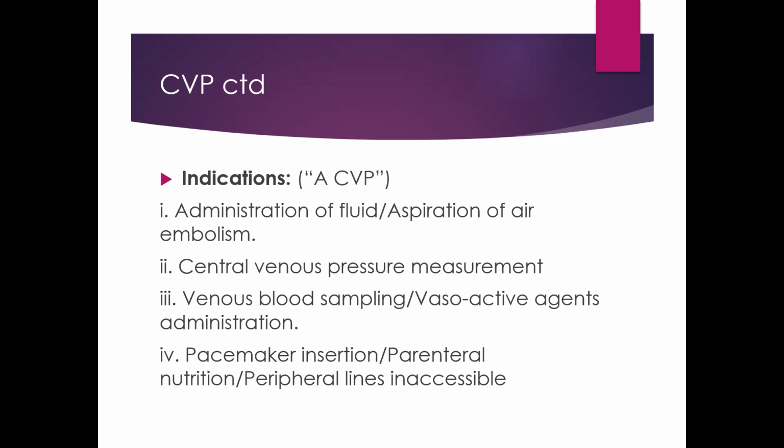Administration of vasoactive agents. These drugs are usually administered through a central line. Pacemaker insertion through your central venous catheter. Parenteral nutrition. And when peripheral lines are inaccessible, in patients with burns to the extremities, or patients who are obese that you can't access a peripheral line.